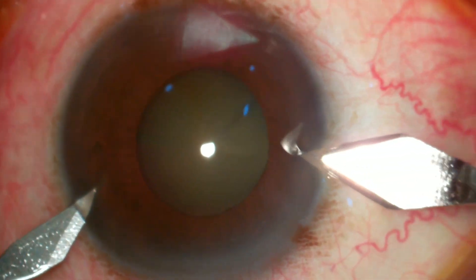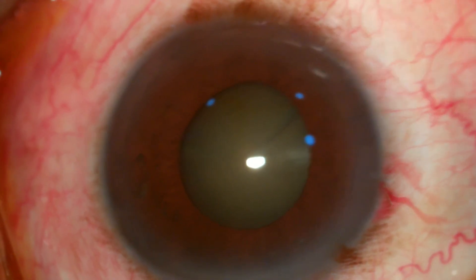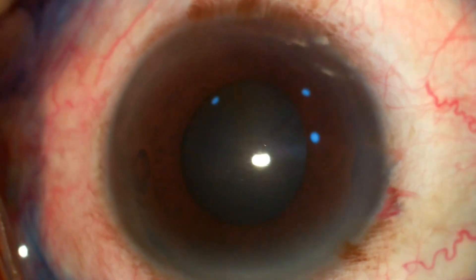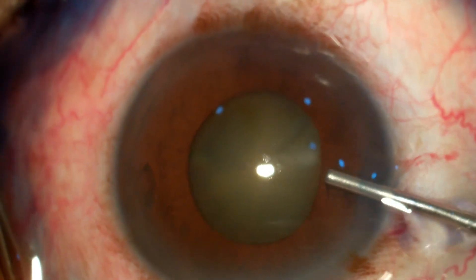Hello friends, my name is Dr. Ali Singal, and today I'm going to demonstrate our technique of phacoemulsification in patients having a small pupil without using any rings and hooks. This patient is having a small pupil, he's diabetic and on prostate medicines.